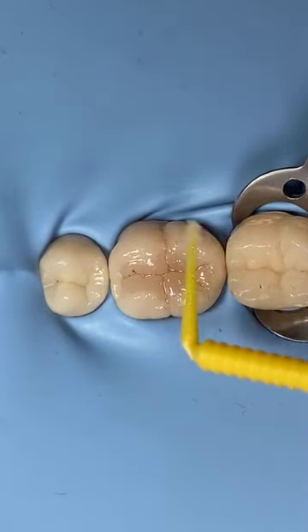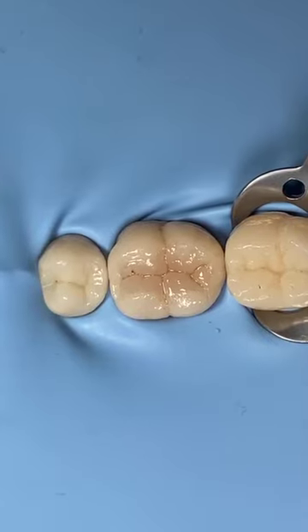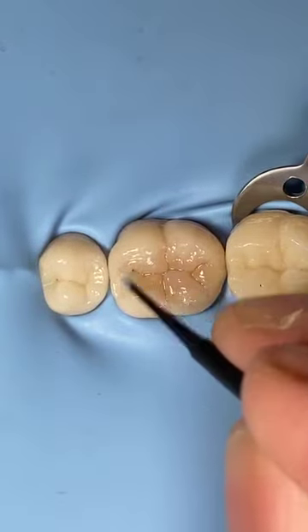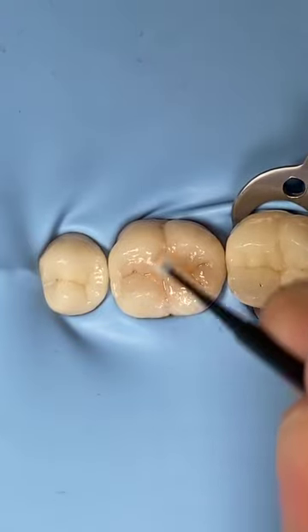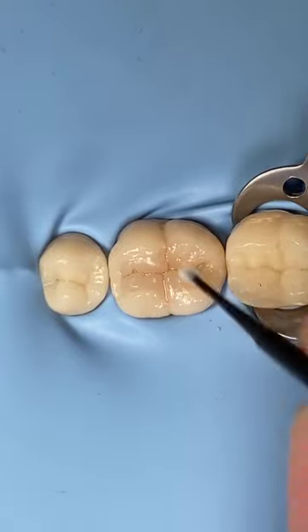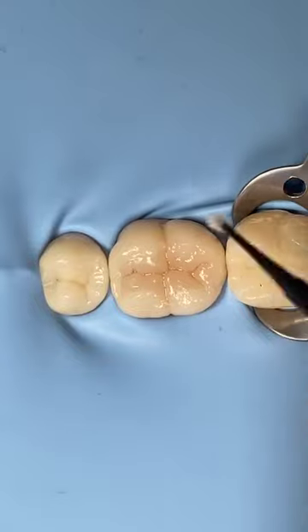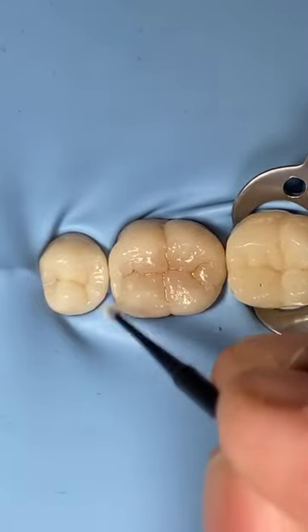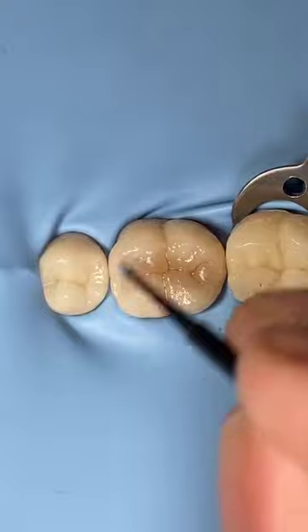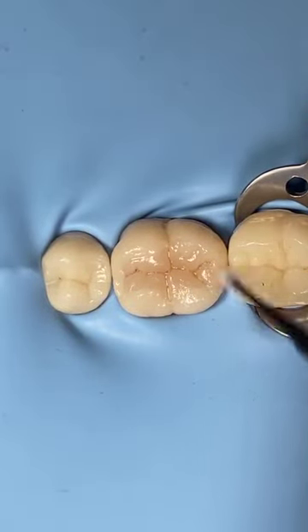You can change the microbrush, and then you put. Okay, I will take a microbrush here. See, no matter how hard you try to remove all the stain, it will not happen because it's already trapped inside. You already created a crack. Fissures, it will trap inside, it will stay there forever.